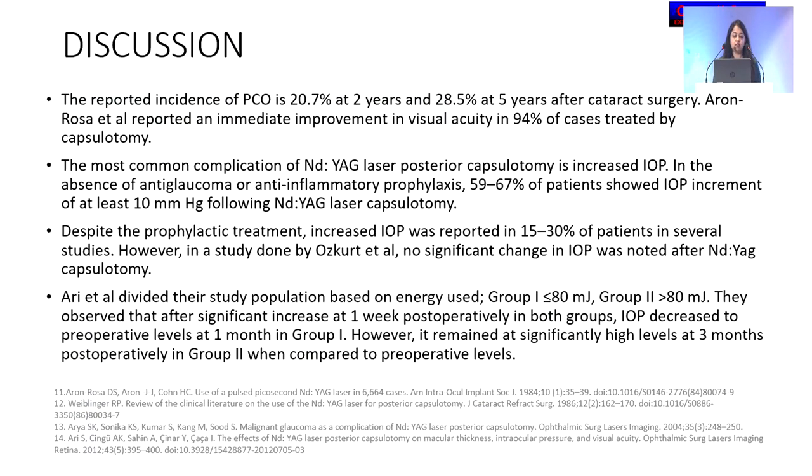So the reported incidence of PCO is around 20% at 2 years and 28.5% at 5 years. And the most common complication of Nd:YAG laser posterior capsulotomy reported is increased IOP. In the absence of any anti-glaucoma or anti-inflammatory prophylaxis, around 59 to 67% of patients showed IOP increment. Despite the prophylactic treatment, increased IOP has been reported in around 15 to 30% of patients. However, in a few studies, they have reported no increase in IOP at all.